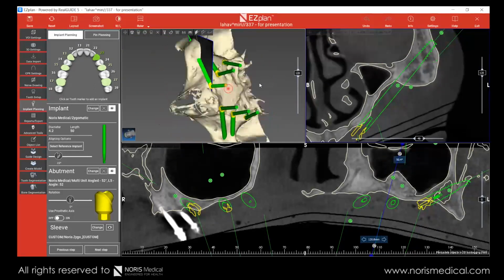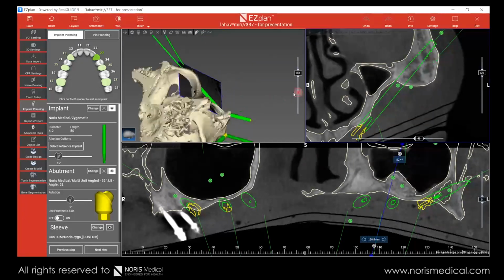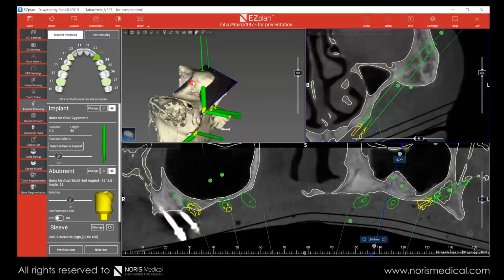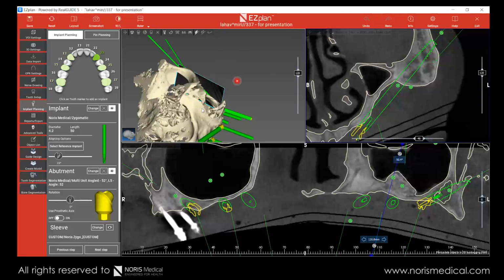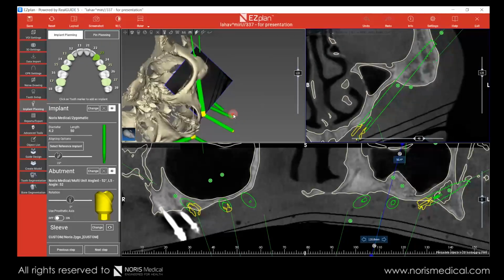By the way, we talked before, look how far we are here. Look how far we are here. If you measure, look how actually close we are to the orbit. This doesn't always tell us if we are right. Sometimes the orbits are very low, they go down. We need to make sure that we know where we are.